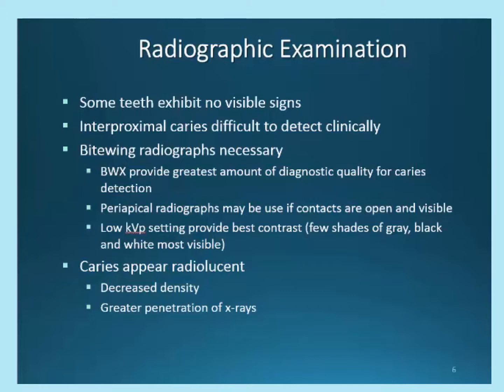In other versions of density used in dental radiographs, we use the term to describe darkness. It is very important to grasp this concept and how it changes when referring to density of an object versus density of an image in a radiographic X-ray. So to recap this thought, density of an object will affect its appearance in an X-ray.